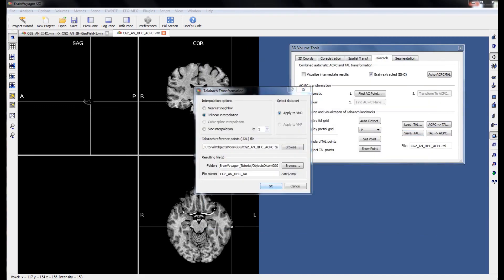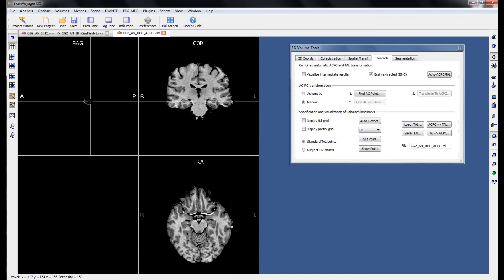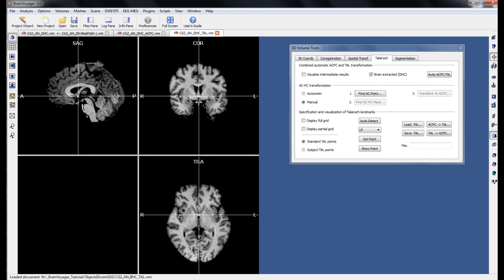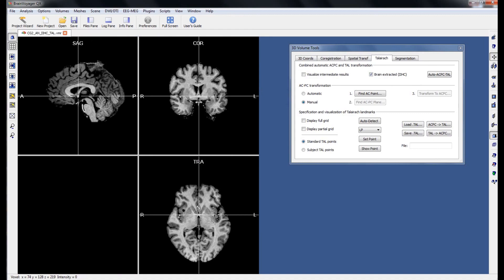And finally we can transform our brain from ACPC space into Talairach space.